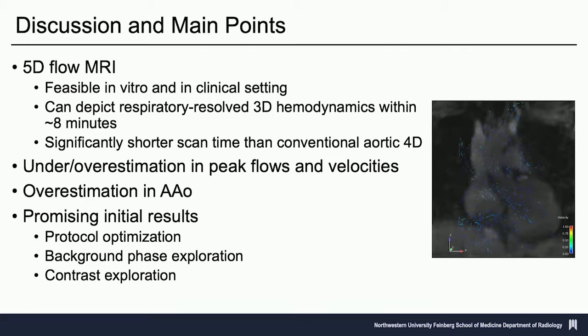Of course, we need to do a lot more protocol optimization and investigation, maybe also more use of Ferumoxytol, which creates this really nice signal. But I think this is promising.